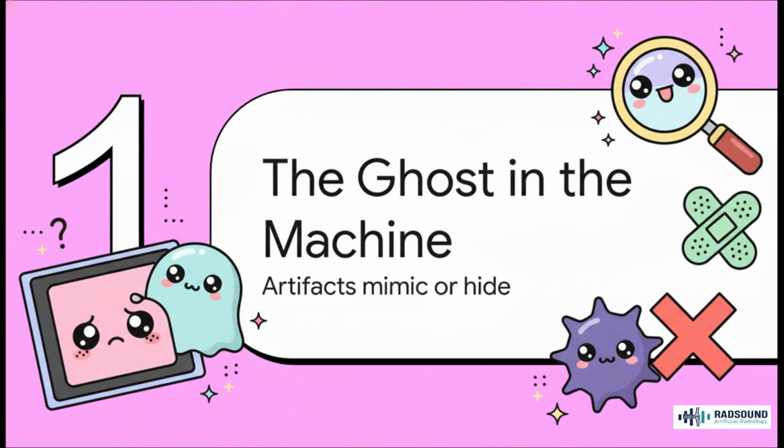An artifact you don't recognize isn't just some small technical glitch. It can have massive consequences. It might hide a real problem, a cancer that gets missed, or it could do the opposite, create a total false alarm, sending a patient for stressful, expensive, and completely unnecessary follow-up tests.